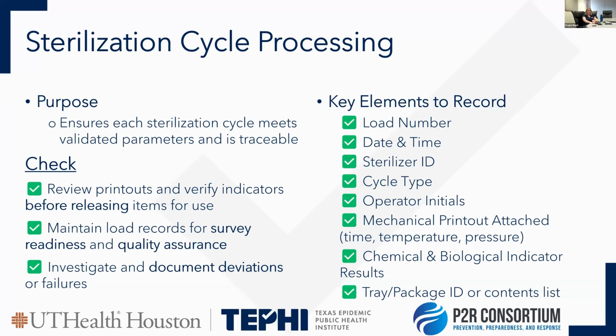We have our chemical indicators, our biological indicators. If the biological indicators have already been ran that day, you see a copy, you look at it, you see the printout, the documentation. You can look at how they stored the load cycles.